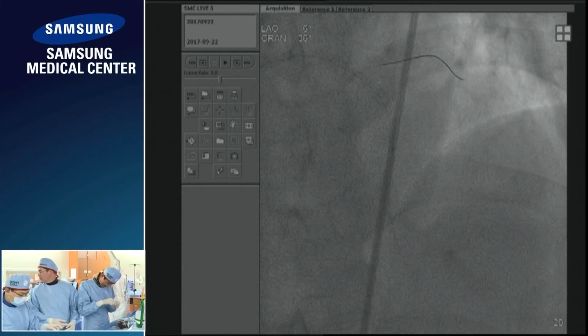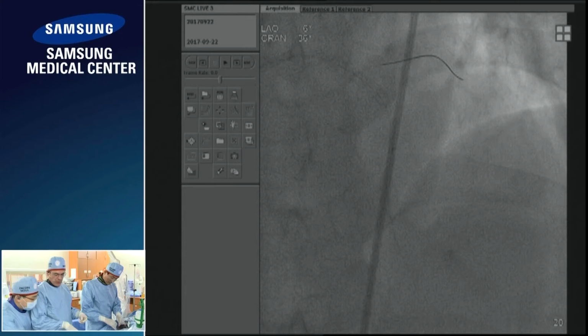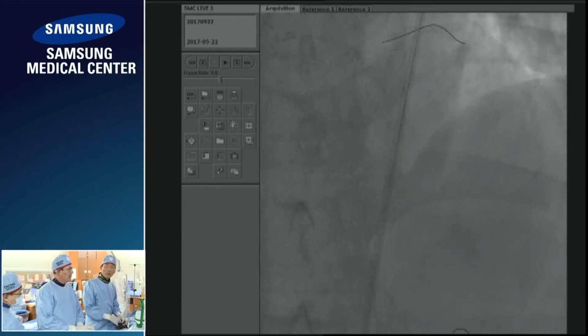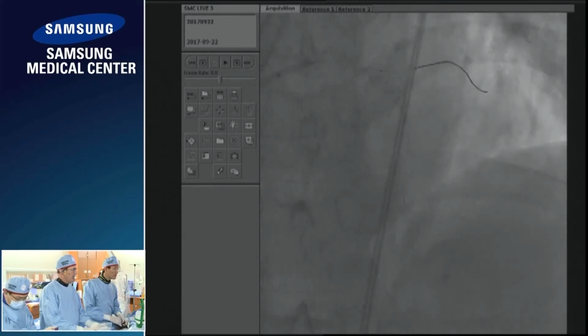So we haven't looked at those pictures. The clearance was reasonable, but we'll get some more information about the left main from this. What injection volume is going in here? Okay. So I didn't see the images. The images are not so clear. Distal to the lesion. No, so let's just do the circumflex and we'll get the left main size there. Still, what we did was just a 1.5 balloon, and if we want, we dilate with a 3.0 balloon or more to show you the mechanism. In the circumflex, you may need to put your wire down a bit further.